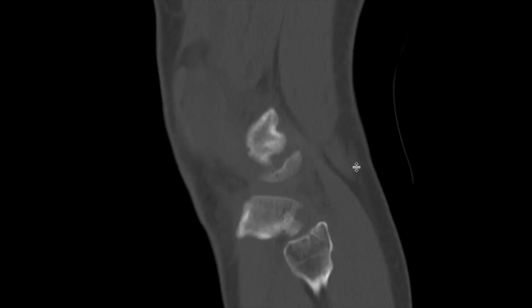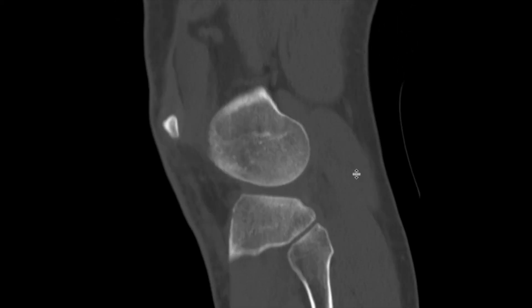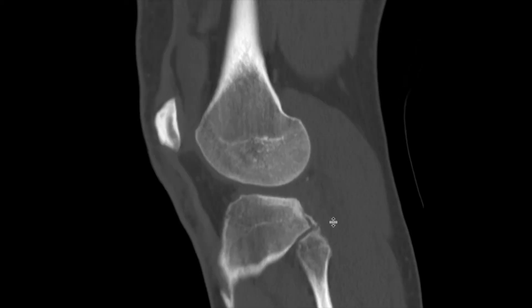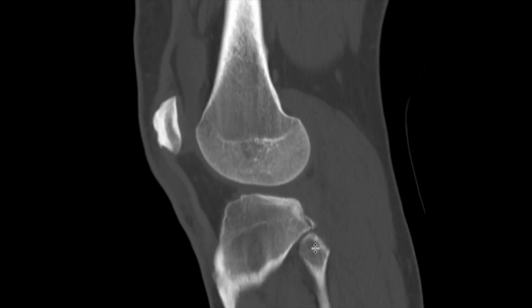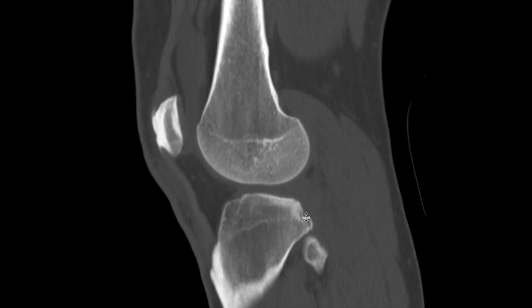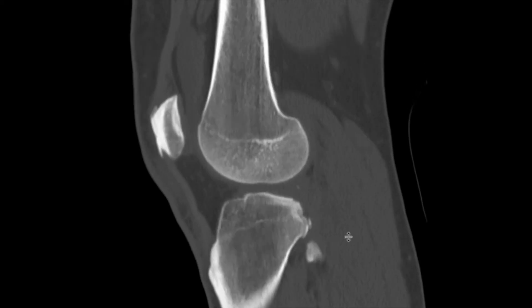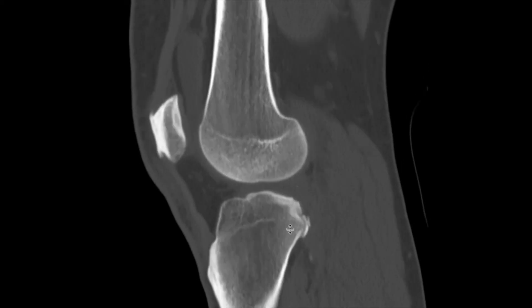When we look on the sagittal view going through the knee — it's lateral because you have the fibula there — again we have an acute cortical step-off with trabecular impaction just subjacent to that. This represents an essentially non-displaced tibial plateau fracture at the lateral aspect.